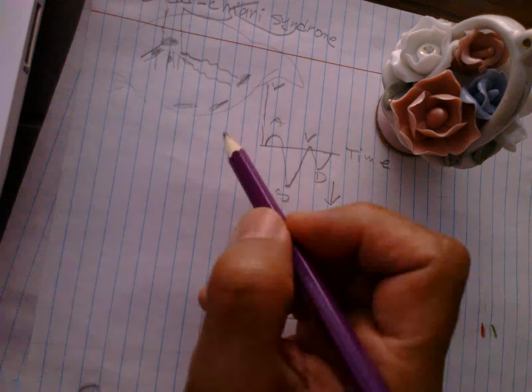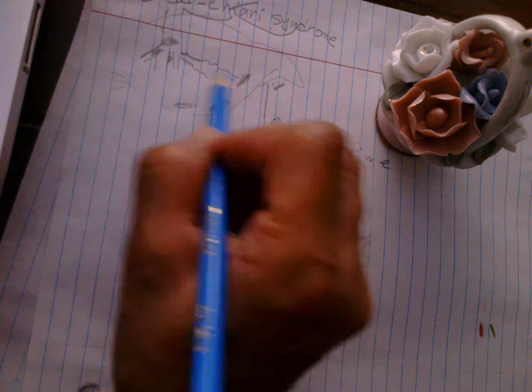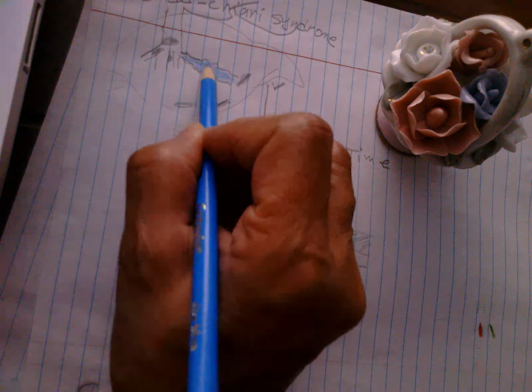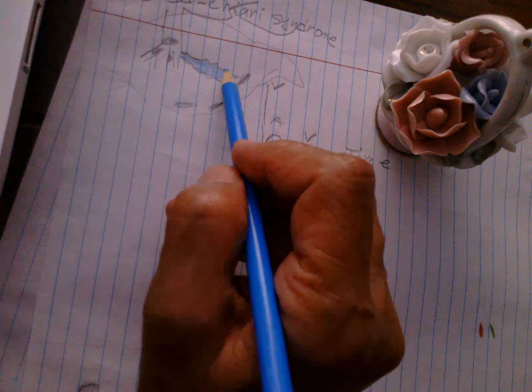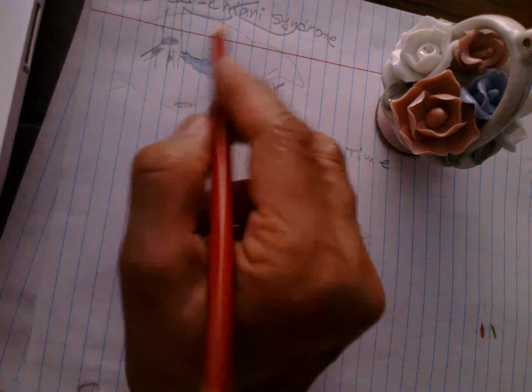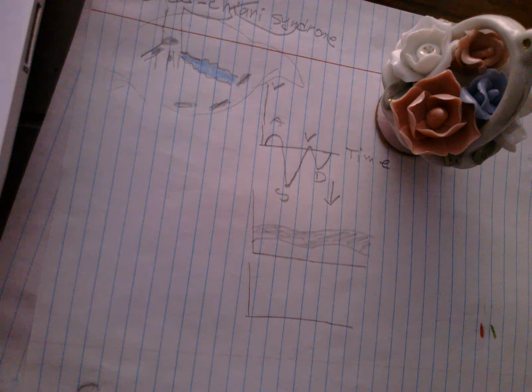And we know that we have too much collateral, or one open hepatic vein that for compensation is larger than normal and with tortuosity, and also maybe flow reversal, the opposite of the normal situation, that is away from the transducer, or normally hepatofugal, but maybe here hepatopetal, or toward the liver.